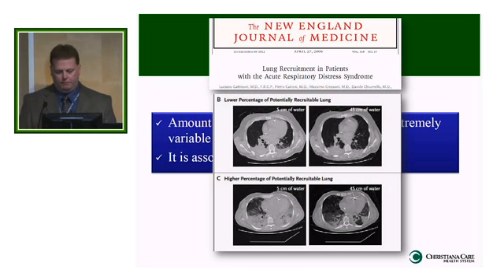So there is a PEEP response effect, where some patients really do not respond to PEEP very much at all, and then you have patients that respond very greatly. They show an image of a patient with a very low percentage of potentially recruitable lung, and at 45 centimeters of water pressure, between 5 and 45, you don't see much of a difference.